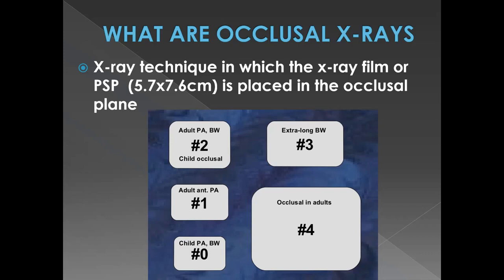For most of the time, I've seen it being used with a mobile intraoral scanner or with a mobile X-ray generator. Anyhow, if this is appearing confusing, I'll share a few pictures of that later on in the group. Basically, you can either use a plain X-ray film that you have in most of our hospitals, or you can have a PSP, which is placed in the occlusal plane.